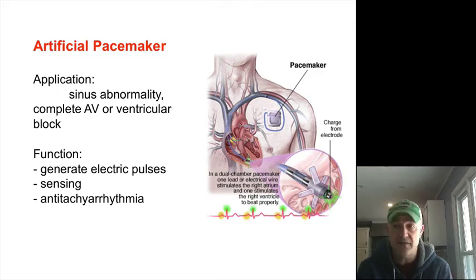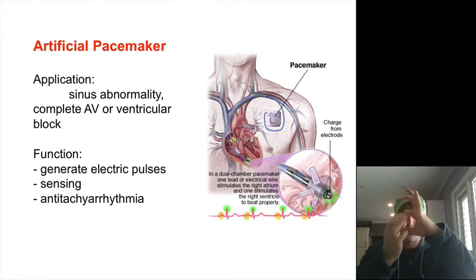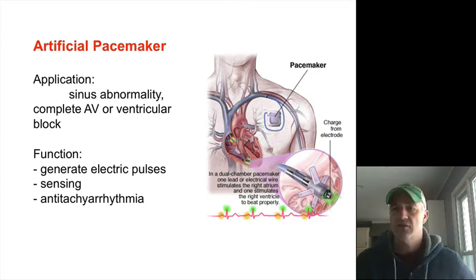Again, some of these are a little bit larger and can have internal defibrillators, which can sense and then act to shock any abnormal rhythm that you might be getting. So pacemakers have a lot of different levels to them. The smallest ones are probably about this big, quite thin. The ones with the defib built in are probably more that size and about half an inch thick, generally implanted under the skin, under the fat, up on the shoulder region here.